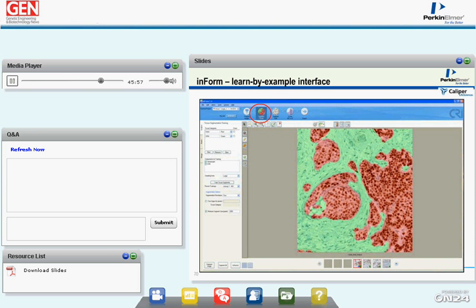And then the software has cellular segmentation algorithms that can go into any of the tissue areas and segment individual cells. In the case that we're addressing here, the interest is in understanding how many tumor cells there are as a percentage of all these cells within the image. So in this case, we would use the data that is behind this image, in other words, the numbers of cells in tumor and the numbers of cells in stroma. We would divide the number of tumor cells by the total number of cells in the image to arrive at a percent malignancy.